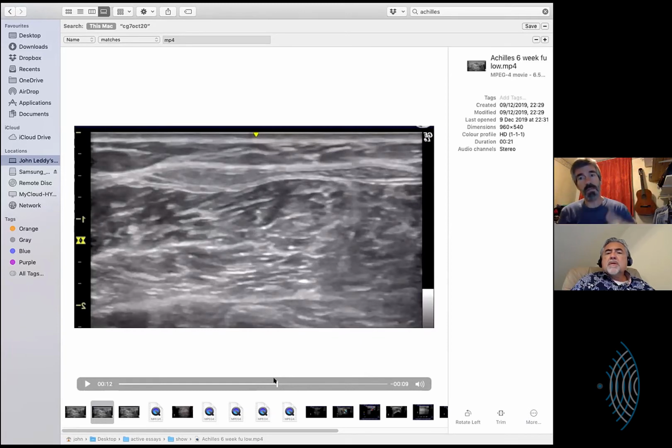So when you come down a muscle like semimembranosus, you're scanning down the thigh, so you're following the thigh, but the fibers are whirling to the side, and they form this little C-shaped, or like celery. I always think of it as a piece of celery. Yeah. Sleeve shape as it goes in, but you're seeing them all being whooshed in and collected, even though the muscle is going this way at you, but the fibers are swirling round and forming on the edge and coming through.